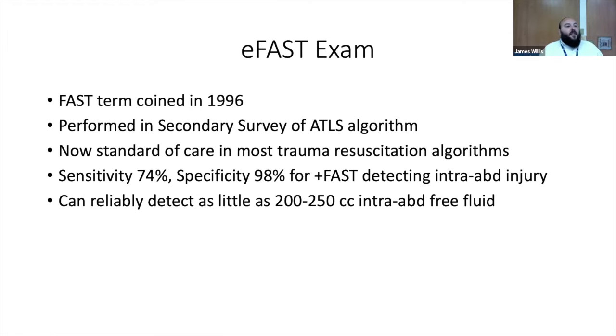It's performed in the secondary survey of the ATLS exam, and it's now the standard of care in most trauma resuscitation algorithms. The sensitivity and specificity of the exam are 74% and 98% respectively for a positive exam detecting intra-abdominal injury. These numbers actually vary depending on the studies that you're reading.